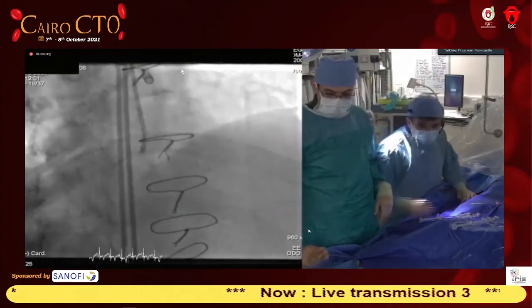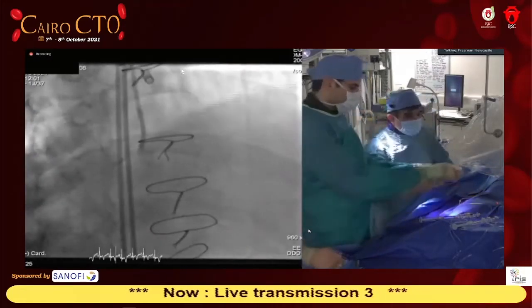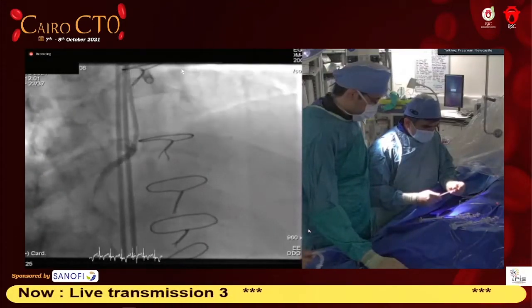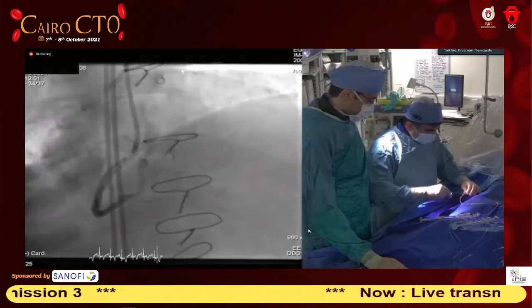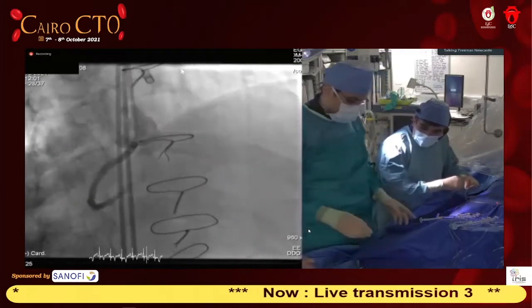It's interesting when you compare the angiogram with the IVUS. Obviously, angiographically, it doesn't look too bad at all, does it? But when you look at the IVUS, you know that there are areas that are not well deployed and still underexpanded, which means we will need some more work. But having seen this now, I think I'm really comfortable coiling that vein graft, because I know we've got a very good result.